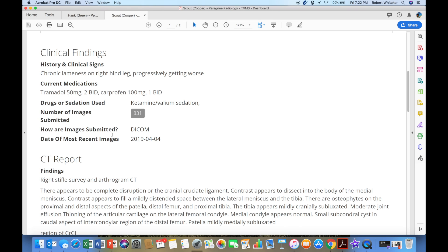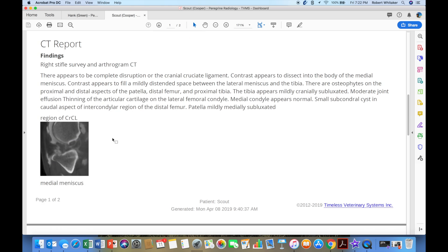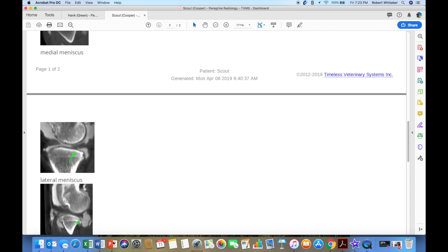If it takes us a while between knees to do contrast in one and then the other, no worries — that contrast isn't going to go away. It's not like an intravenous injection of contrast where we're racing the clock before it all ends up in the bladder. So here we go down and start looking at Scout's images. It appears to be complete disruption of the cranial cruciate ligament. If you look at the cranial cruciate screenshot on the report, it looks like a fine mess — there's just contrast everywhere, and we don't really see a definitive cruciate anywhere.